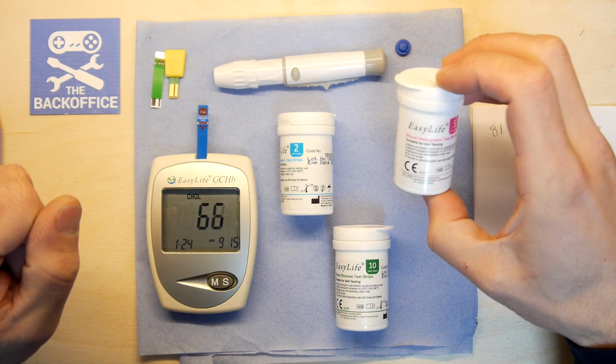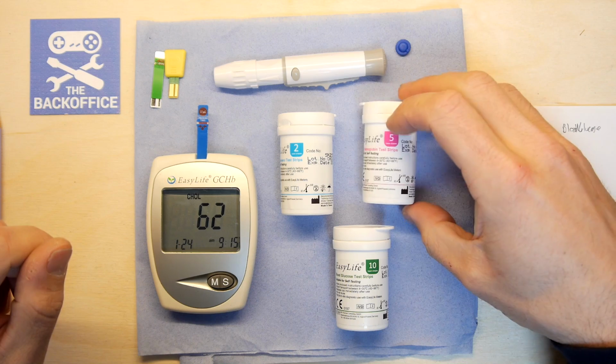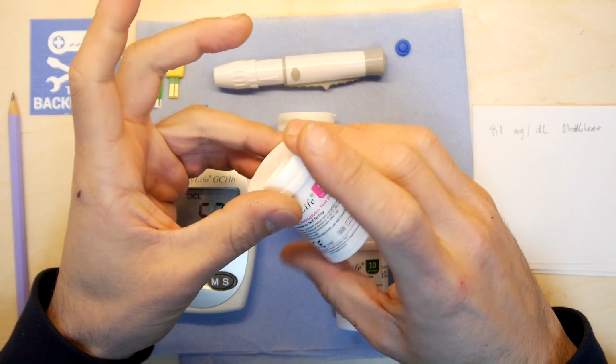Hemoglobin, again, I don't know, there's 5 there. Again, 2 months. It all says 2 months on these, so they're not going to last very long, really. But hemoglobin's an interesting one because I think that's what people have if they're anemic or not.